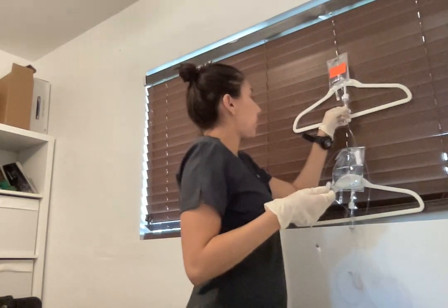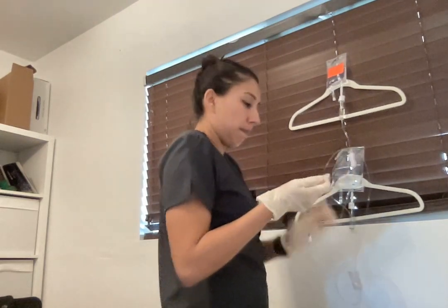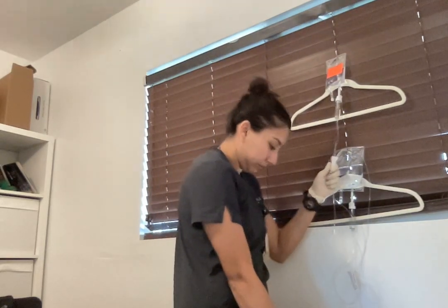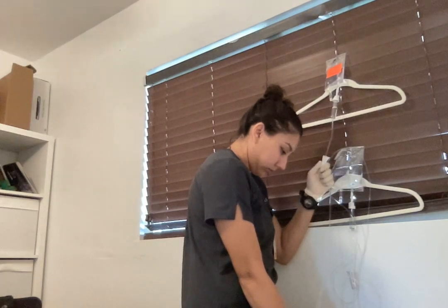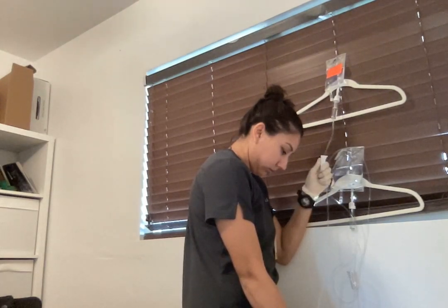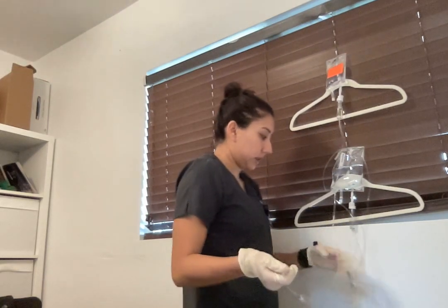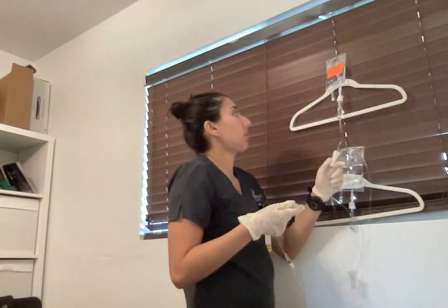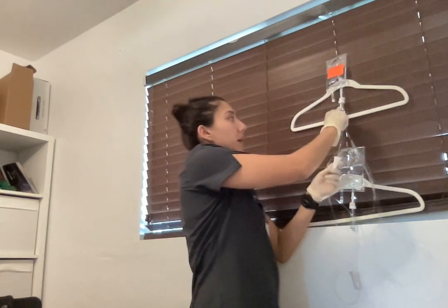I'm gonna squeeze this chamber to make sure there's fluid about halfway. I'm gonna clear the line, make sure there's no air bubbles, a couple drops. Alrighty. So now since that line is clear, I'm gonna count for 1 minute. Make sure that's equivalent to 100 drops in here.